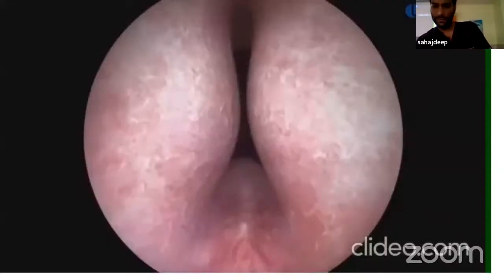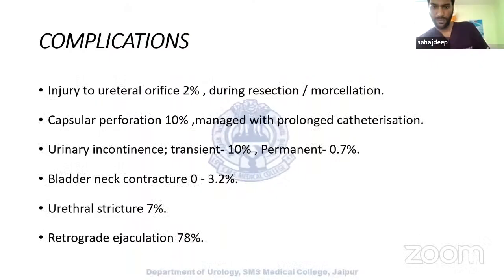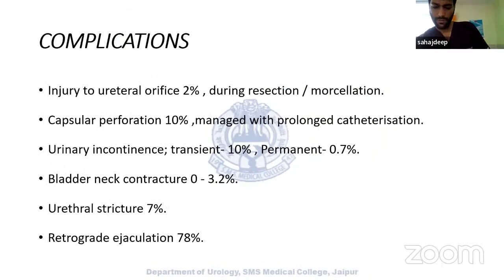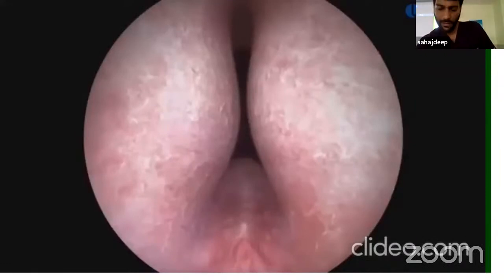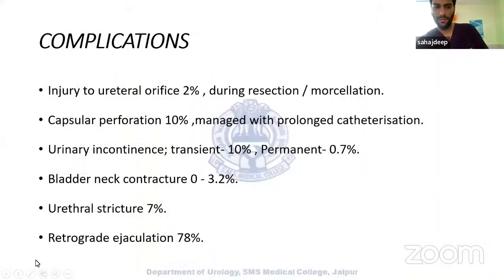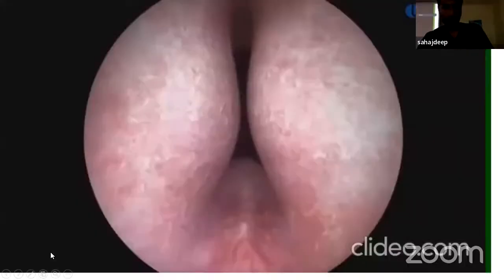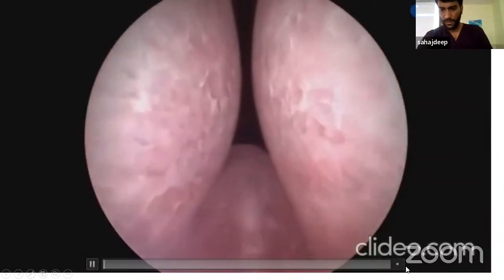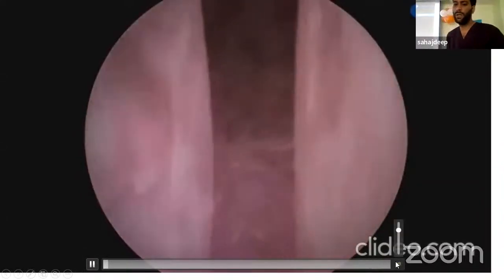This is a video showing the HoLEP procedure.